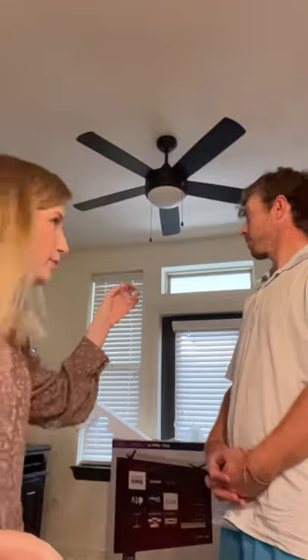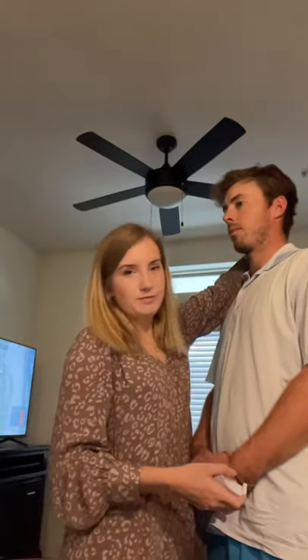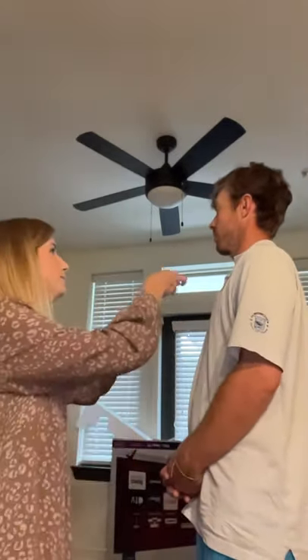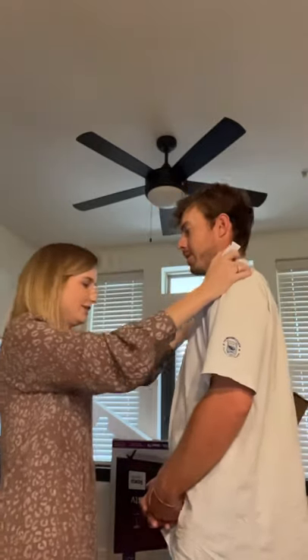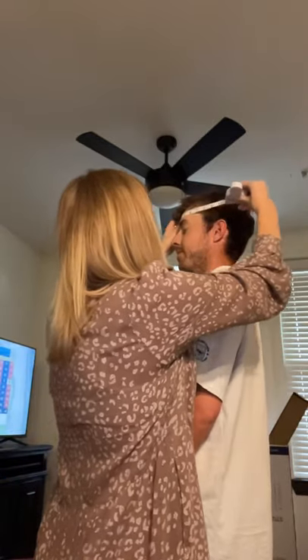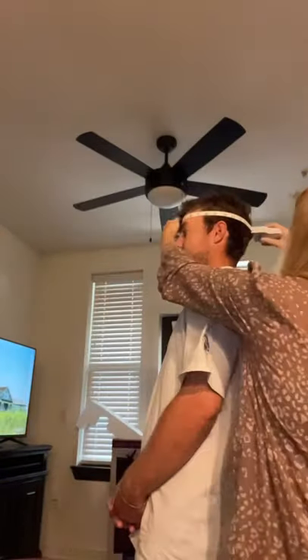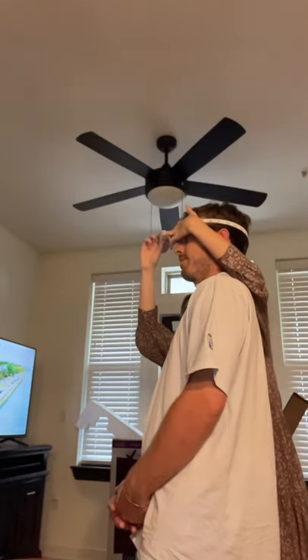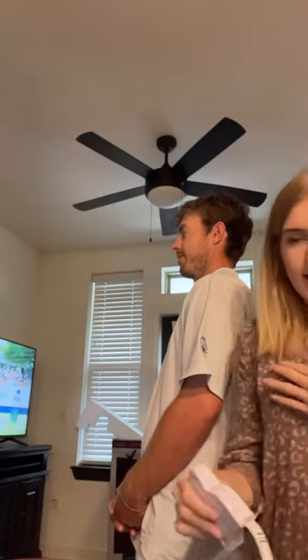Now we're going to do his head circumference. We're going to find the broadest part of his head — normally above the eyebrow, above the ears, and the back part of his head that sticks out the most, the most prominent part. We are at 24 and a half inches.